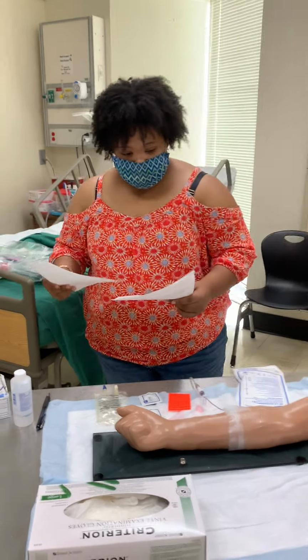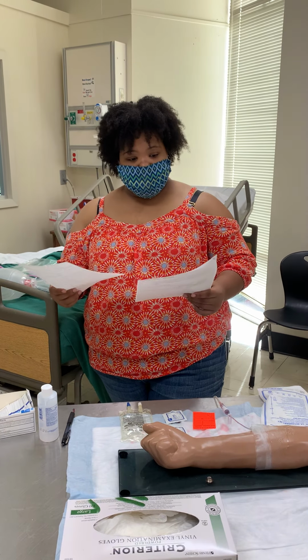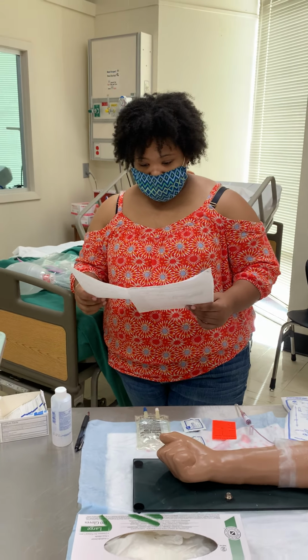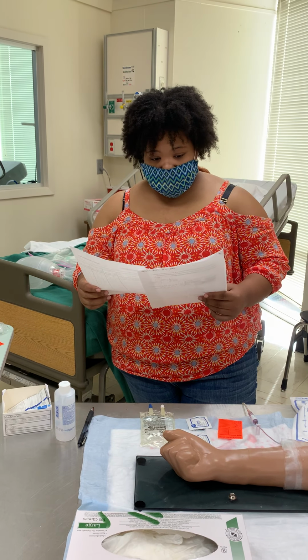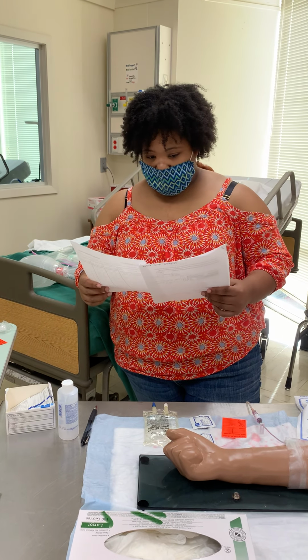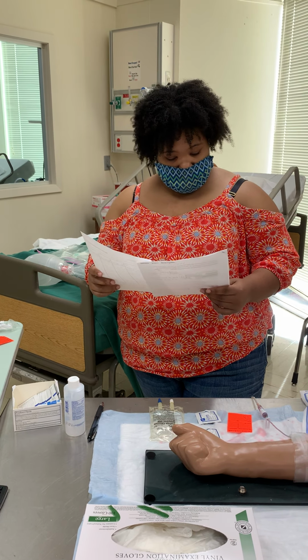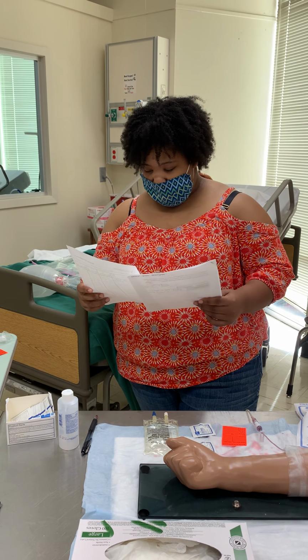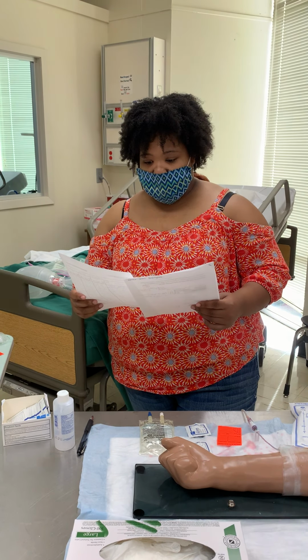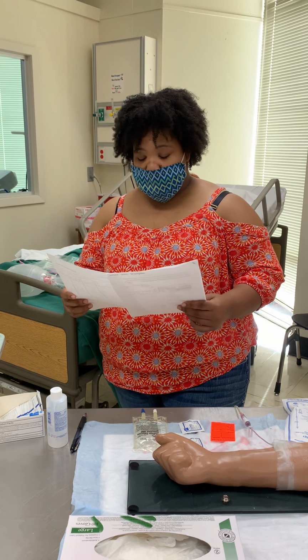All right, so I'm going to check my physician's orders with my MAR. Okay, so here I see I have gentamicin 60 milligrams, IV piggyback every 8 hours. It says the same thing right here. I'm checking for allergies, and I see that my patient doesn't have any allergies. So it's the correct solution, and it's the right rate.